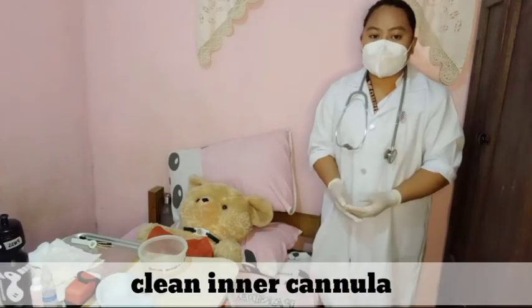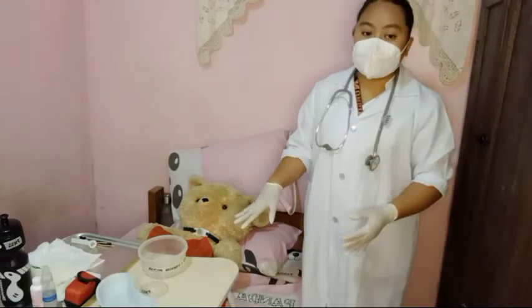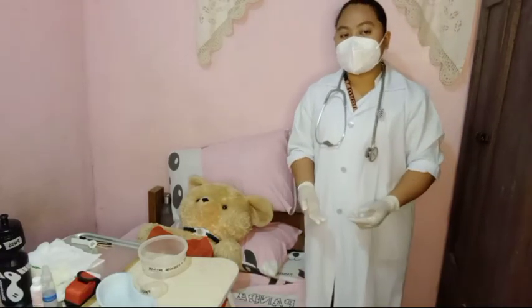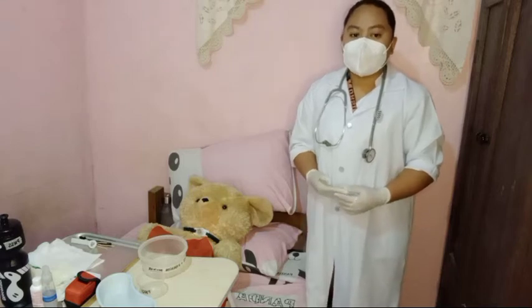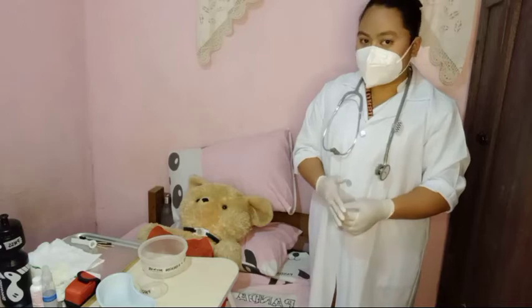Then clean the inner cannula using the prepared plain NSS and hydrogen peroxide, and use the brush to remove the solidified or sticky mucus.